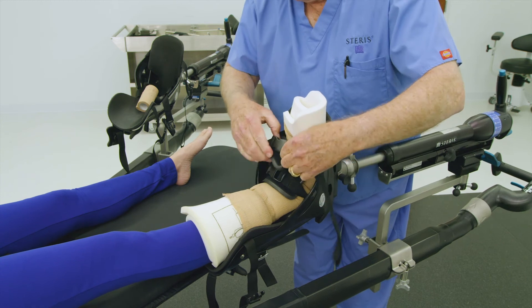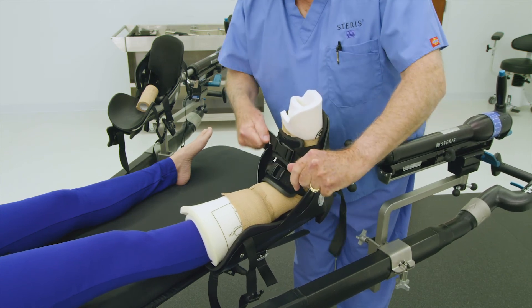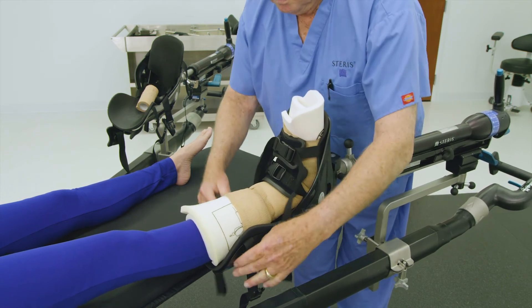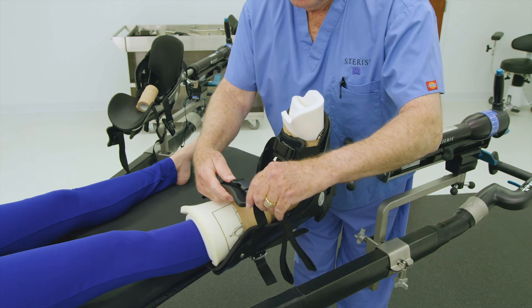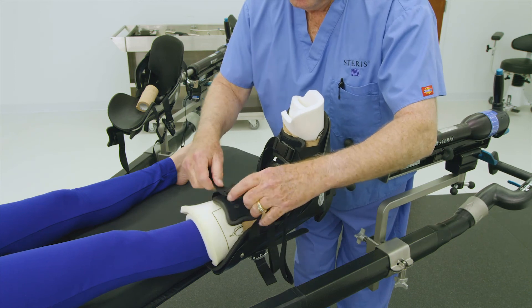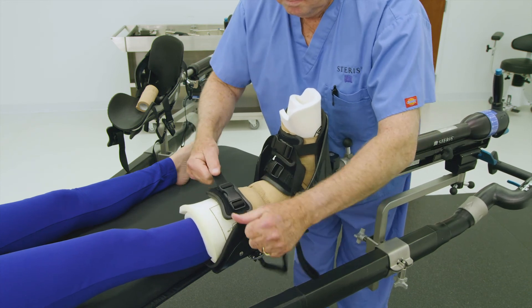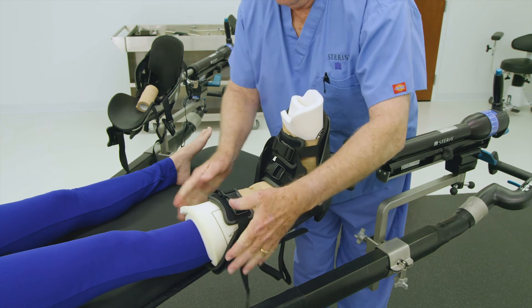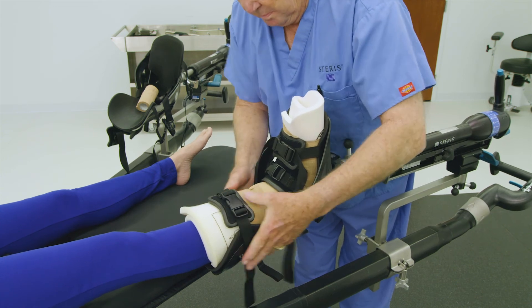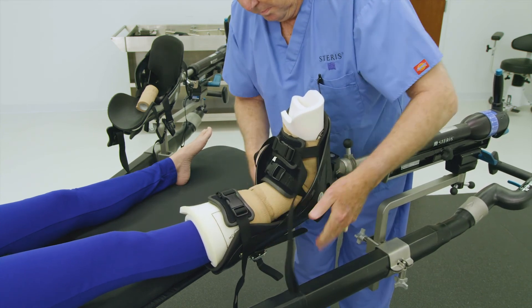Failure to follow these steps could lead to the patient's foot slipping out of the traction boot. Repeat these steps with the other patient's foot as clinically necessary. Some orthopedic procedures may only require one patient's foot in leg traction.